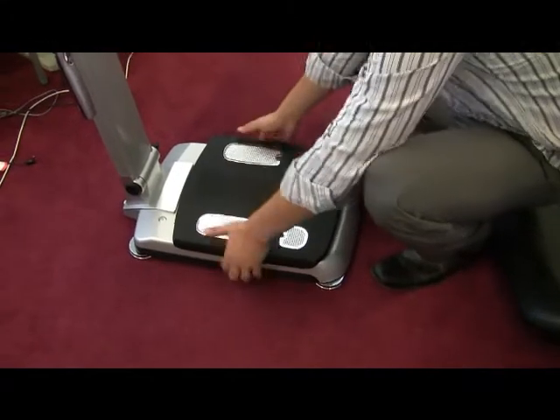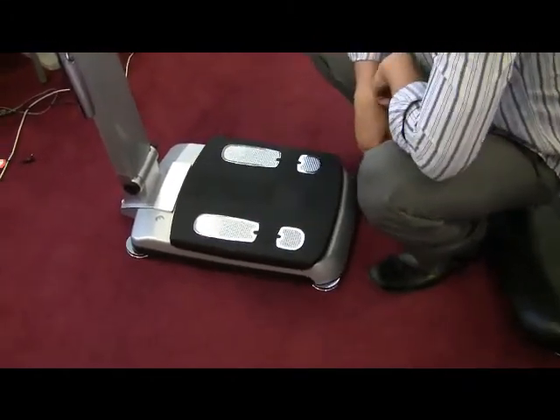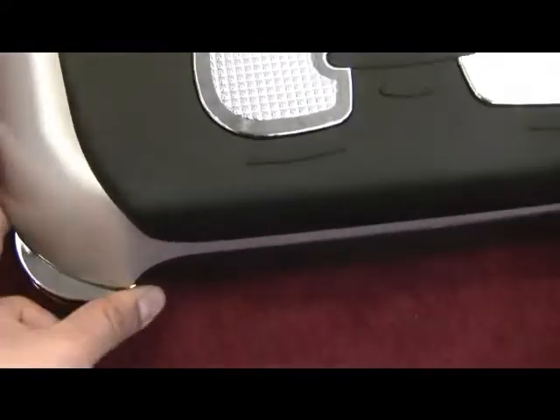Balance the InBody 230. By applying pressure to the footplate, check to see if it needs to be balanced. You can also use the bubble leveler. Adjust the balance if necessary by rotating each foot support.